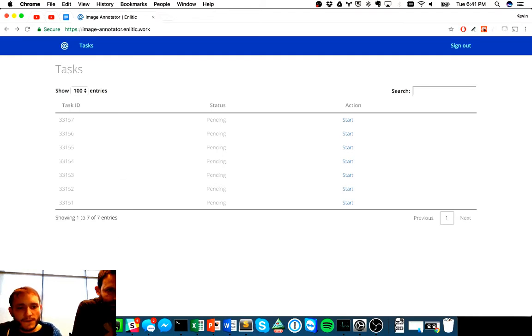The first set of cases that you'll go through will include about 50, and that'll give us a good sense of your performance on this particular task. And we'll use that to QA those cases and then get back to you with feedback or anything that we've noted about how to move forward. After we've had a chance to discuss your results with you on the first 50, then we'll open you up to start labeling as many chest x-rays as you'd like.